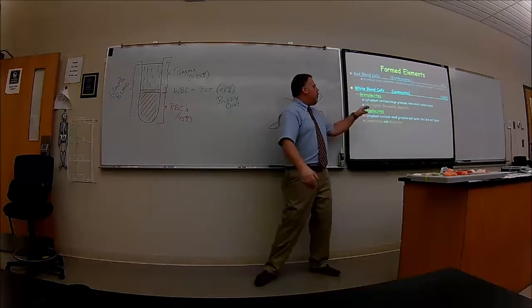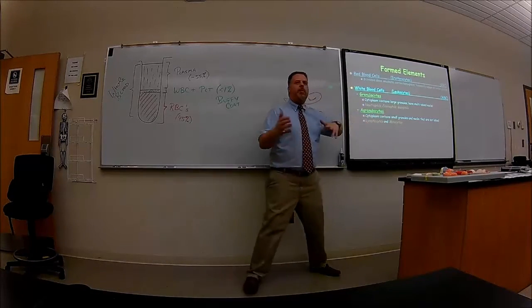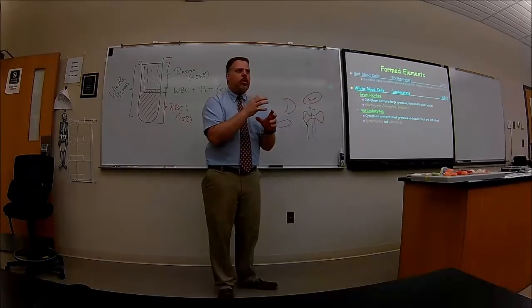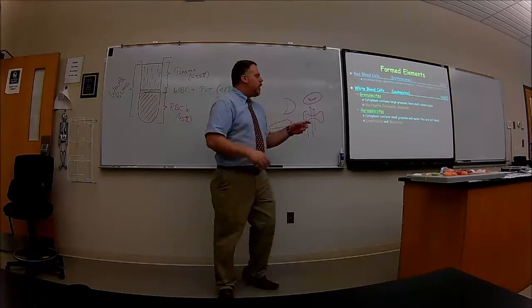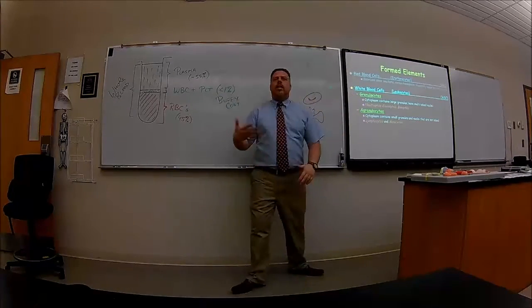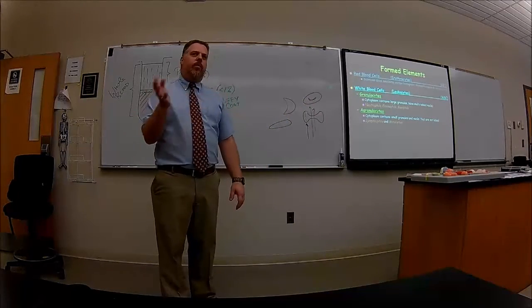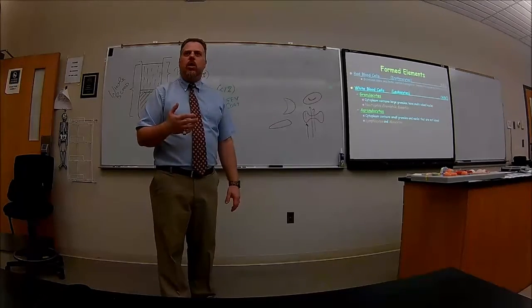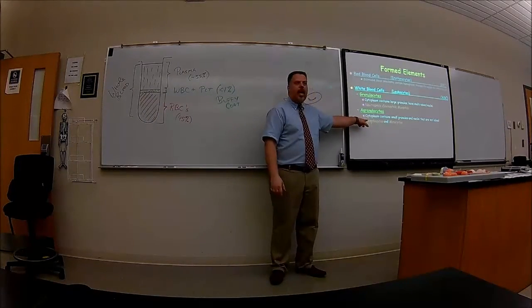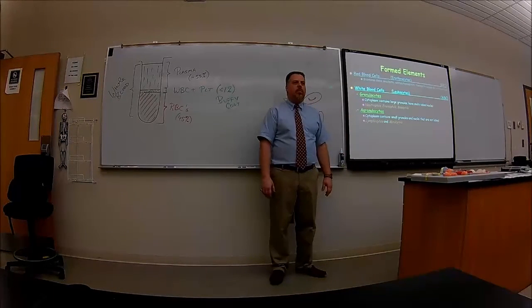See, what happened was, when they came up with this nomenclature and identification back in the 1800s, they noticed under the very small, primitive microscopes that there were granules here, but no granules here. Until they got the electron microscope eons later. Not eons, but maybe the mid-1900s. And now, when they looked at it much closer with an electron microscope, they noticed that they have granules here, but they never changed the name.